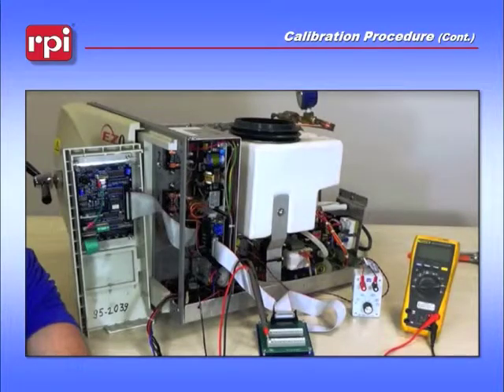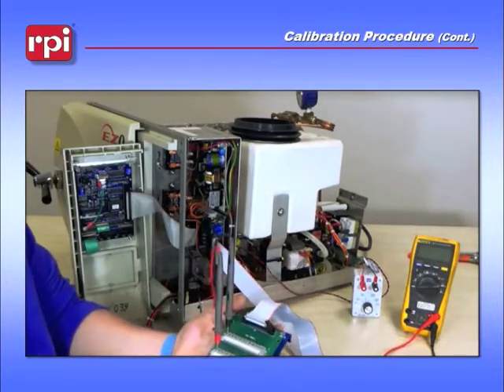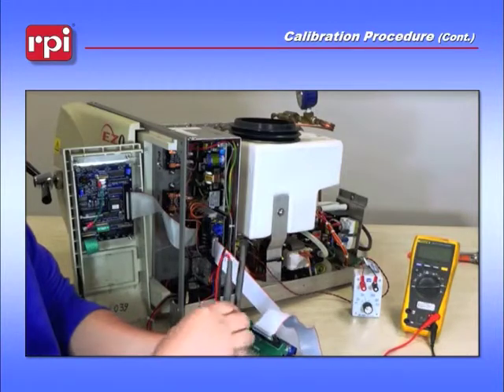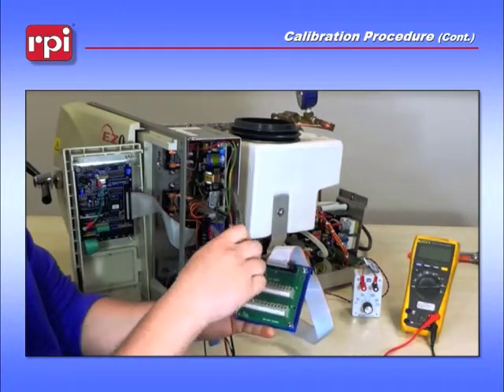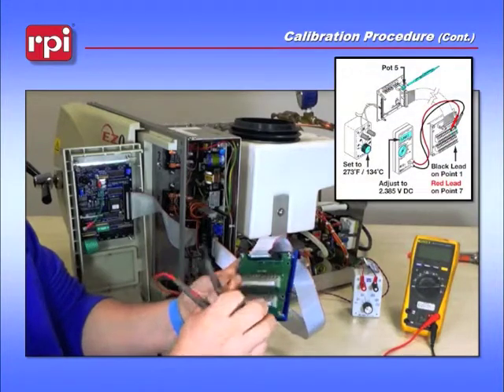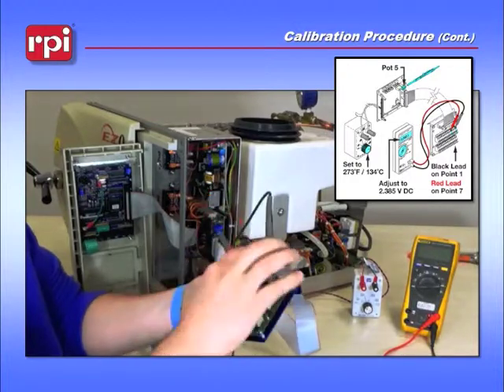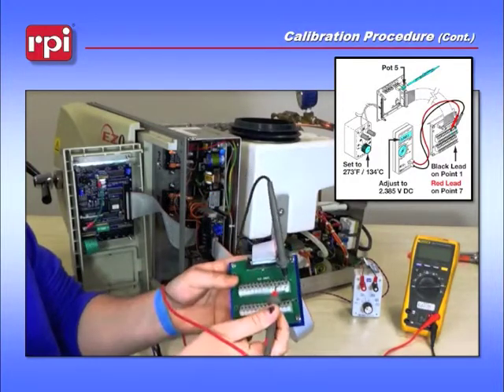The next step in the calibration procedure is to take your TUB-109 board and move your leads from test points 25 and 26 — black lead to test point 1 and red lead to test point 7.